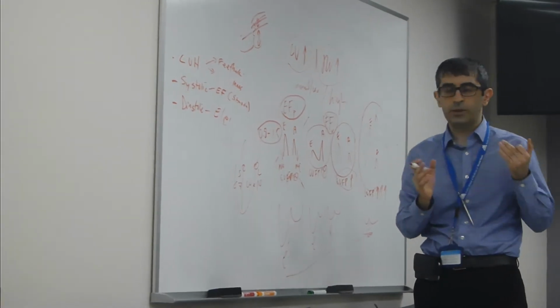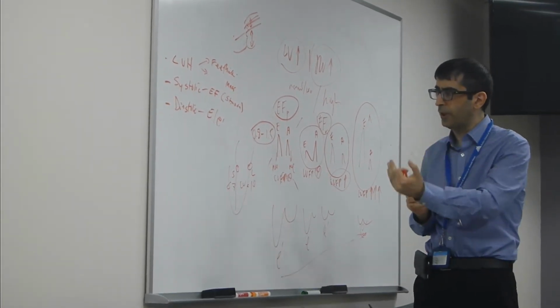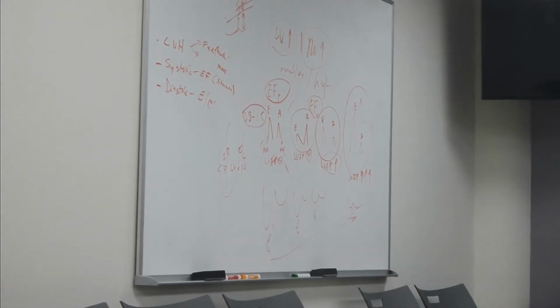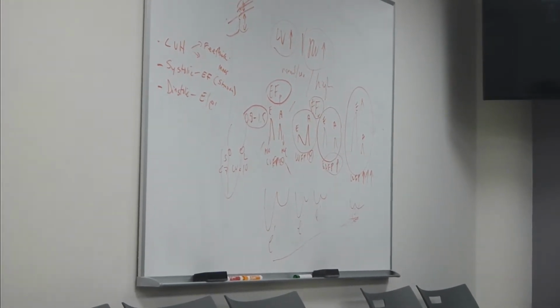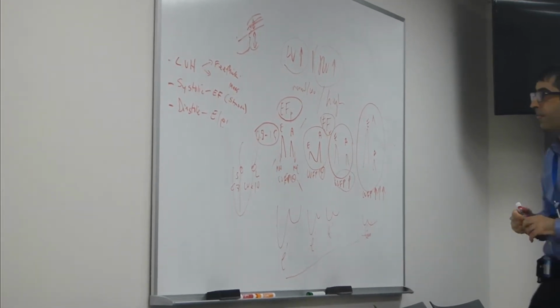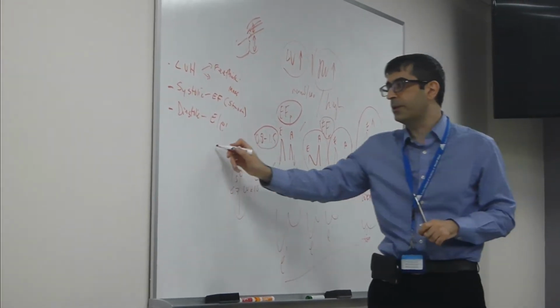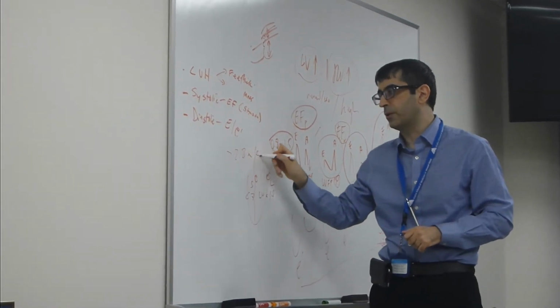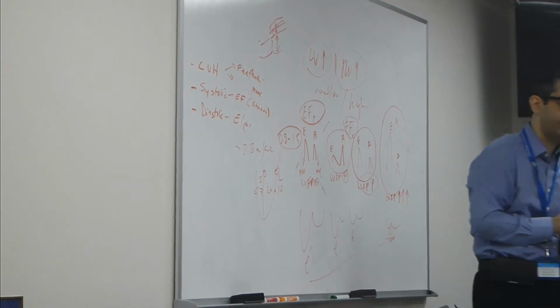So TR velocity is the gradient between the right ventricle and the right atrium, and usually an increased TR velocity is a sign of pulmonary hypertension. Right? So if your velocity is more than 2.8, it usually indicates that there is some degree of pulmonary hypertension.